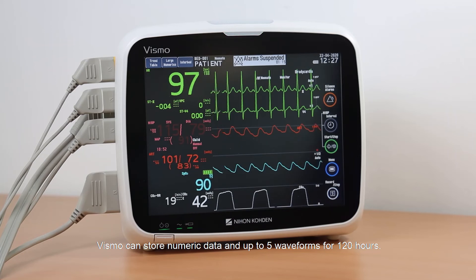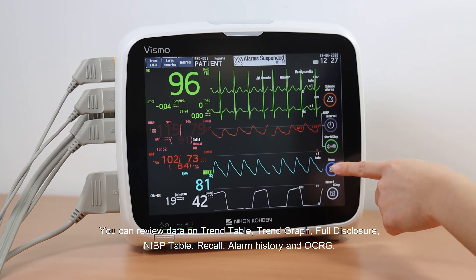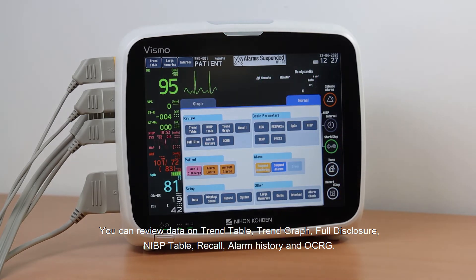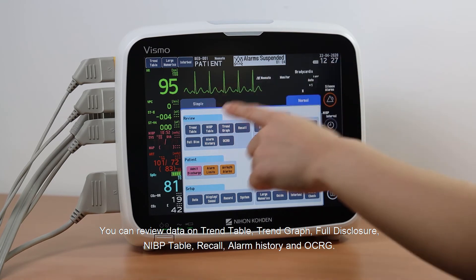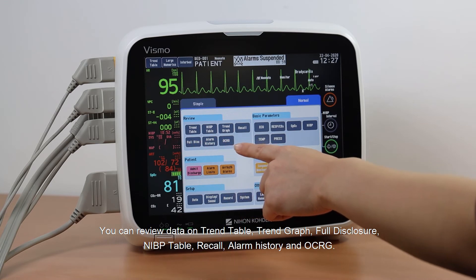Vismo can store numeric data and up to 5 waveforms for 120 hours. You can review data on the Trend Table, Trend Graph, Full Disclosure, NIBP Table, Recall, Alarm History, and OCRG.